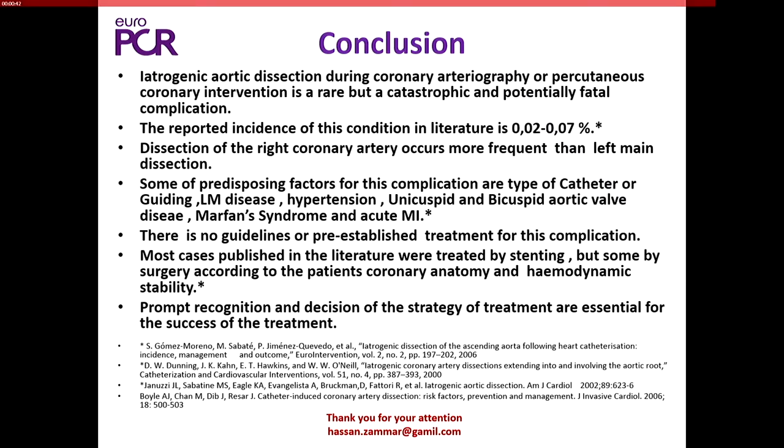Did you remember and check your heart rate when you saw the first picture? Over 120, maybe over 150. Because I was during the round and I was called to see what was happening in the cath lab, and that was my first angio.